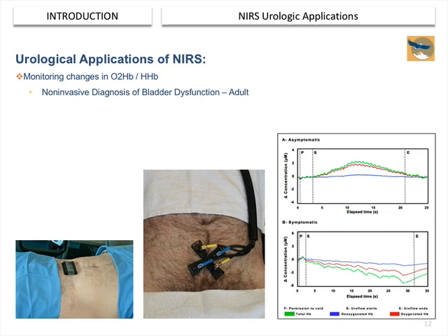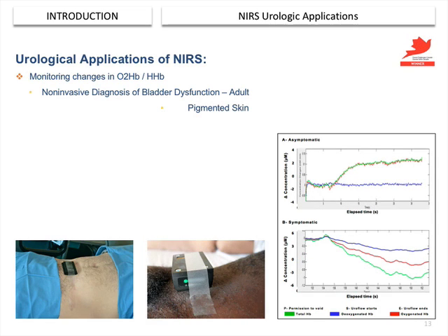And then we showed the same thing in adults, again decreasing oxygenated hemoglobin during voiding. Recently, in a Grand Challenges Canada research, we went to Uganda and showed that skin pigmentation is not a barrier, so no problem with pigmentation. We can easily monitor the bladder.